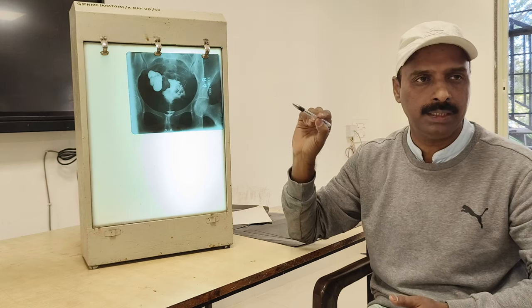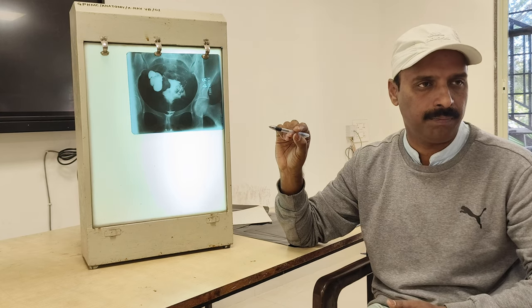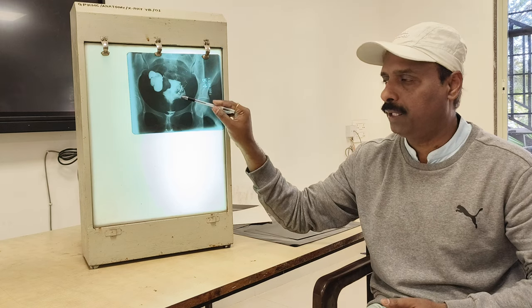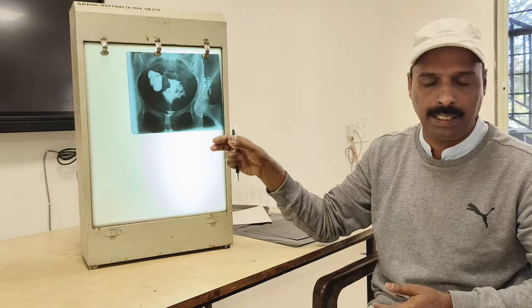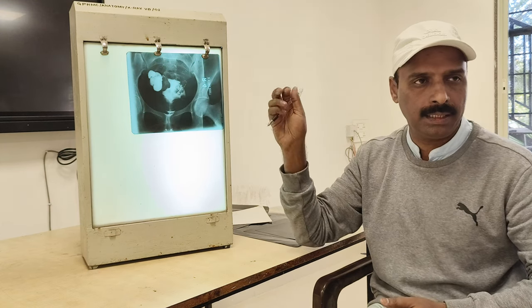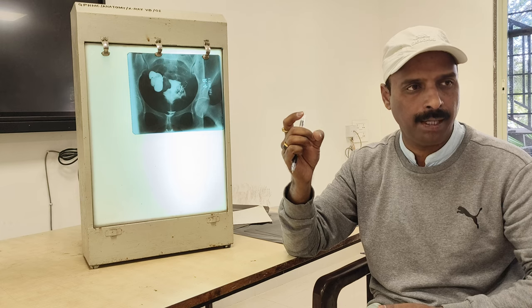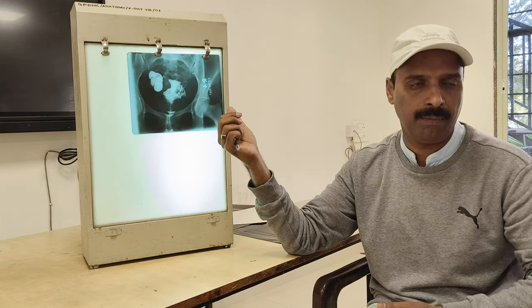So this is what we call salpingography. This is also a contrast variety of X-ray. Among the contrast studies I have told you barium meal, barium follow through, barium enema, then IVP, and then hysterosalpingography.